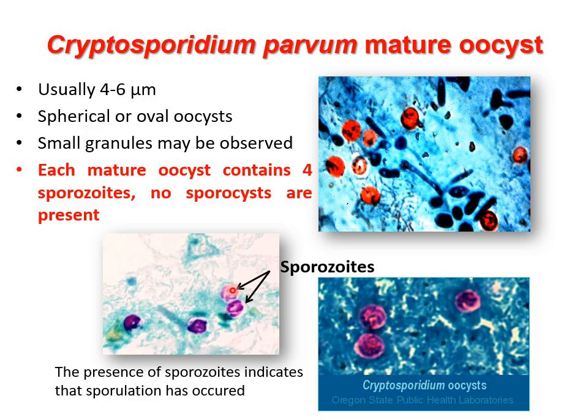We do not have a sporocyst inside of these. What we have is four sporozoites that are naked without a sporocyst. So in the oocyst of Cryptosporidium parvum, we directly see four sporozoites that are naked without a sporocyst, which disintegrates under the pH of the digestive tract upon formation. And we can stain these oocysts by acid fast stain methods, and we can count, like here for example, this one is very nice, 1, 2, 3 and 4. So there are 4 sporozoites, and these oocysts can be directly infective.